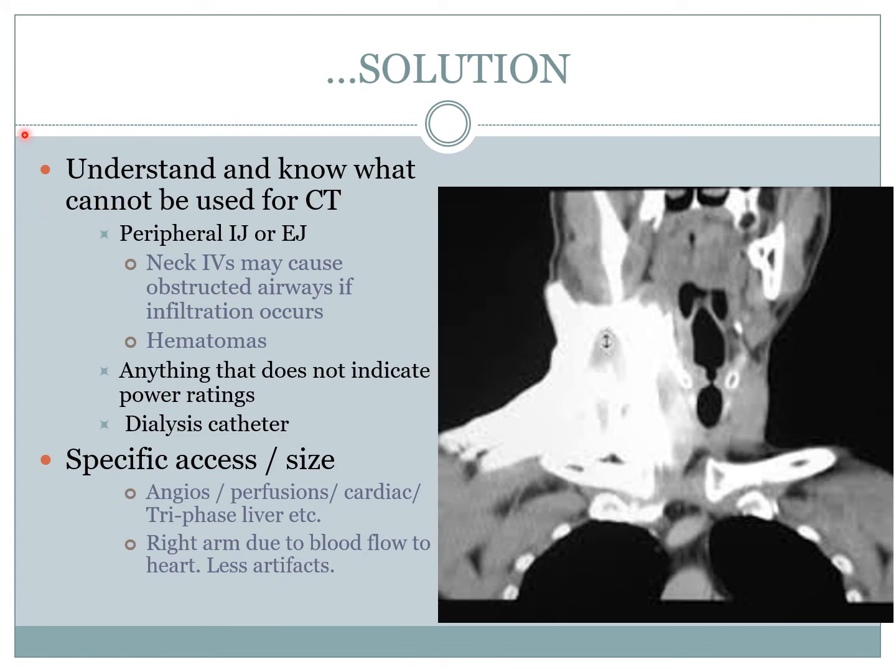Another solution to this is to understand and know what cannot be used for a CT. And what I mean by this is we need to know what we cannot use. As I mentioned earlier, if there's nothing telling you that there's a power rating, don't use it. There is no way we can find out. Do not use it. It's safer for the patient.